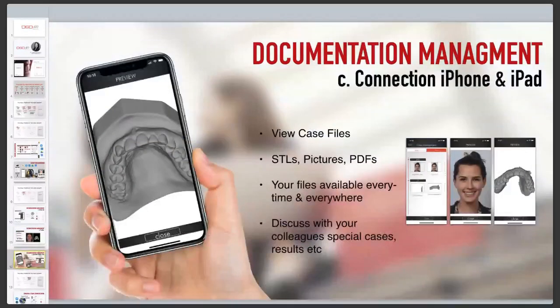So it makes multidisciplinary treatment planning really happen, because how many times are we trying to plan a case, communicating with our colleague or with another specialist that we work with, and we don't have the right file at the right time. So having these at our fingertips, on our phones or in our iPads, makes all of this connection in the case management much easier.